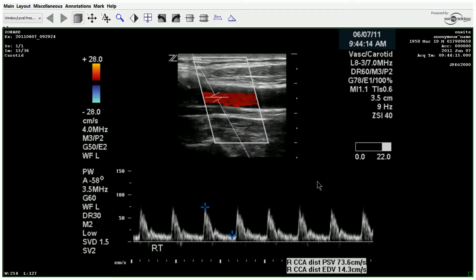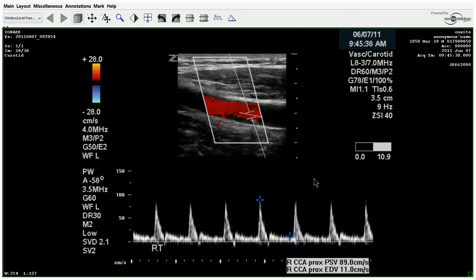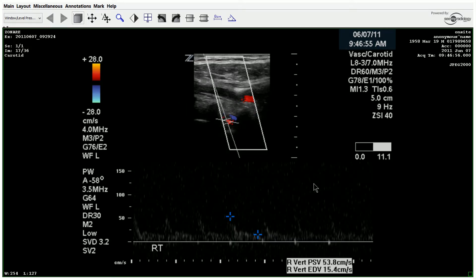Moving on, you can see the actual hemodynamics of the CCA haven't changed all that much. This appears to be a fairly new occlusion. For the vertebral flow, we could have turned up the spectral gain here just to see that better.